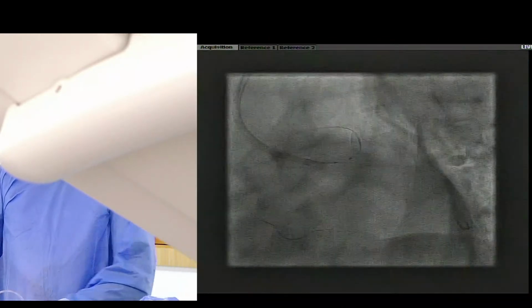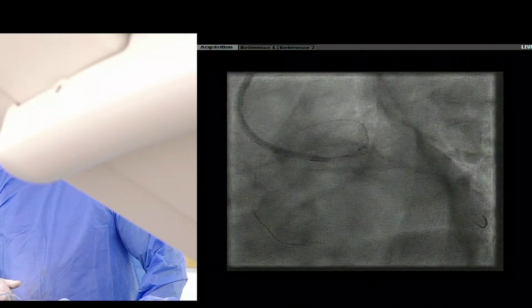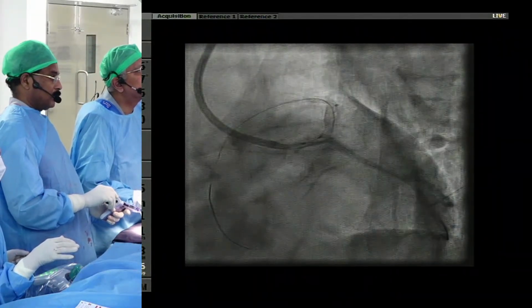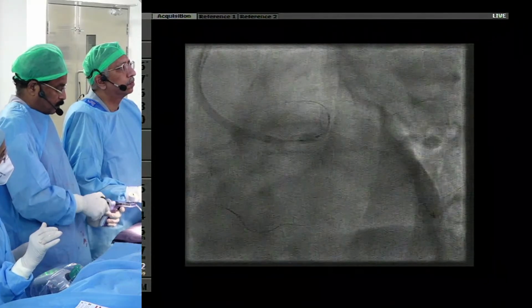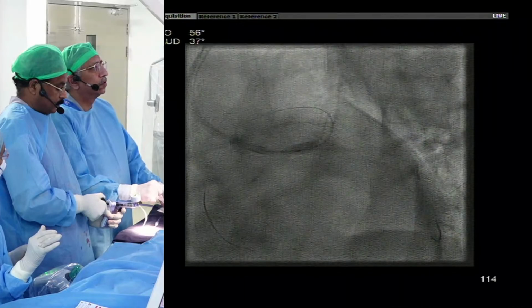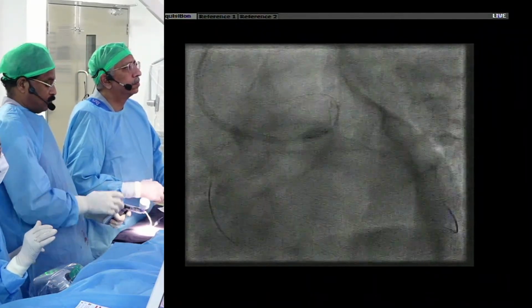Yeah, I think just angiographically, you could tell that you're going to have to land in the left main. Probably I would have landed on the body of the left main because I'd be concerned about how big the ostium gets, and I don't think you always need to cover the ostium. Leaving out a POT, the question is, what do you get from the panel? Does everybody kiss now for left mains, if you have a great result after provisional with the POT, or do you leave it alone?